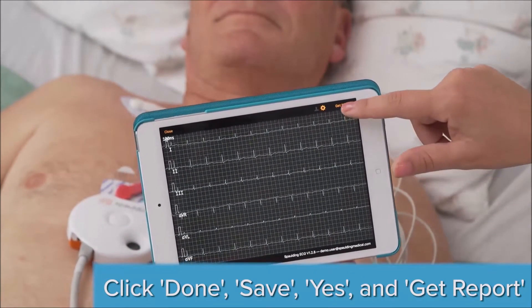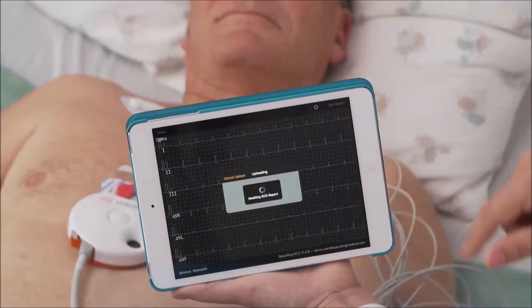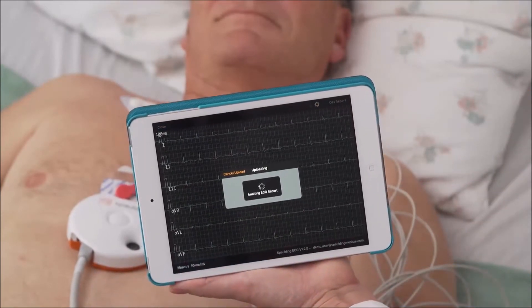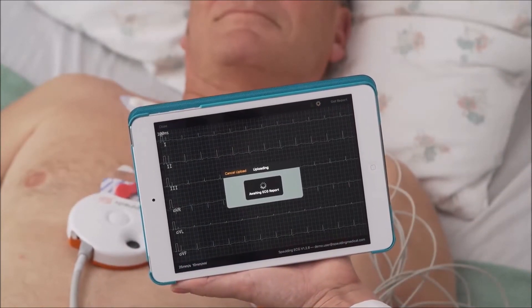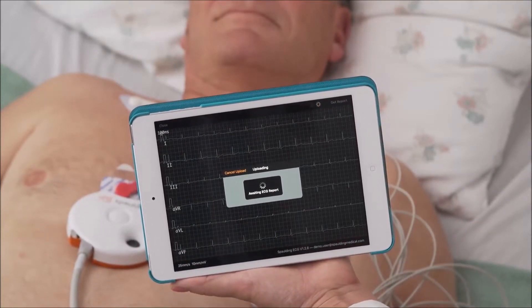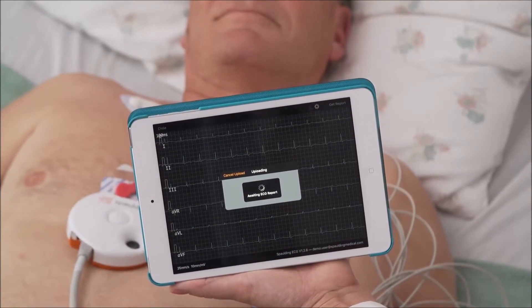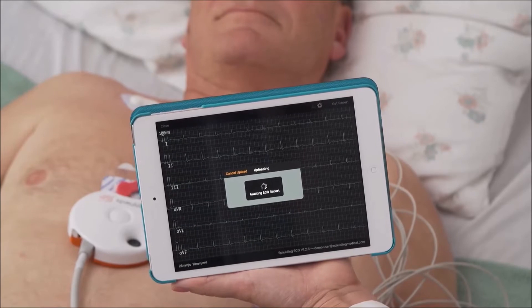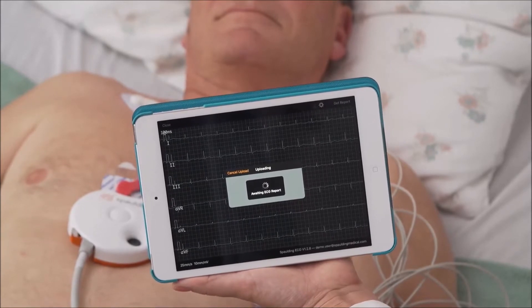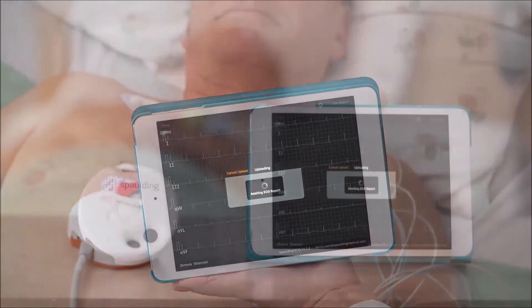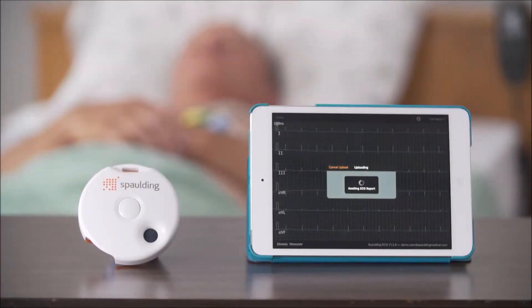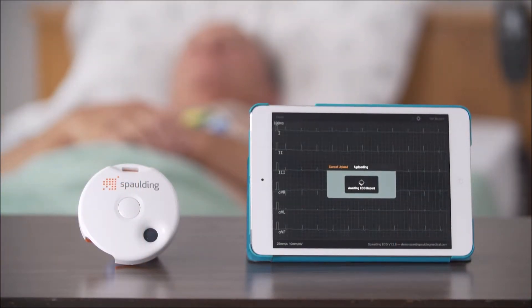Click Get Report in the upper right-hand corner to send to our cloud-based server for algorithm analysis. You'll see an icon appear that says Awaiting Report. This is also the moment in which your automated workflow is being enacted.